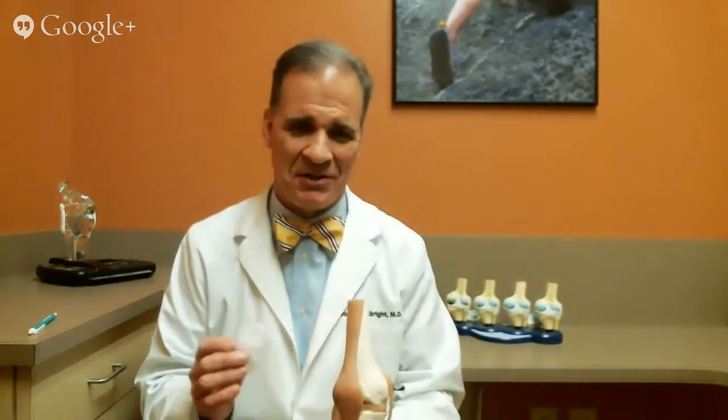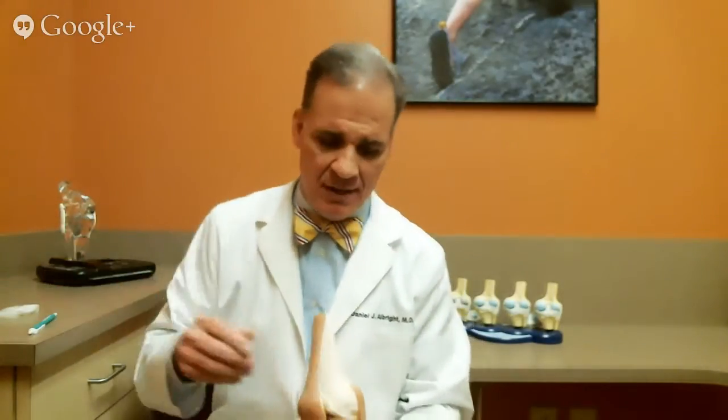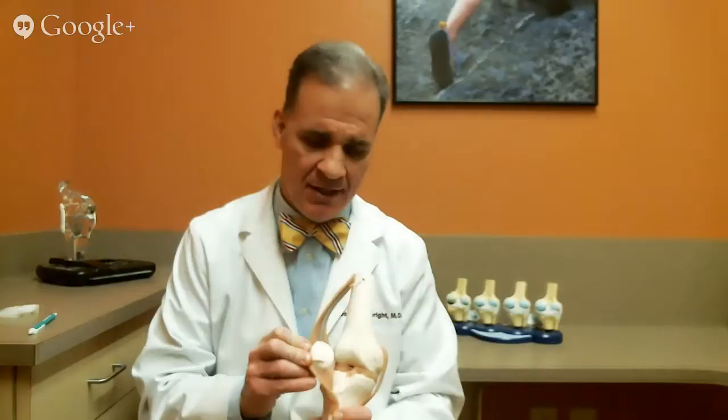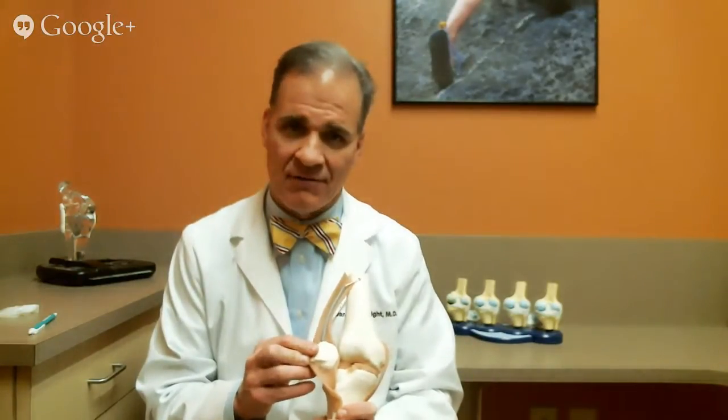Then you put a piece of plastic between the two. This plastic has been around a number of years; there's a lot of good research and the hope is that the plastic lasts 20 years. It replaces the cartilage that goes between the two pieces of metal. Then you're almost done. The last part is the kneecap, the patella. You shave the undersurface off and you glue on a plastic button in place. When you're done, everything moves as a unit.